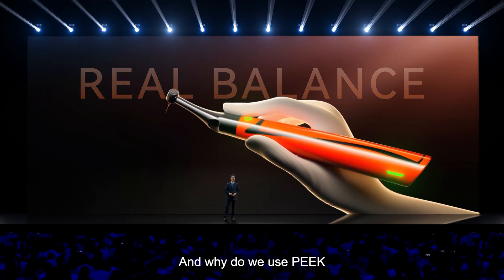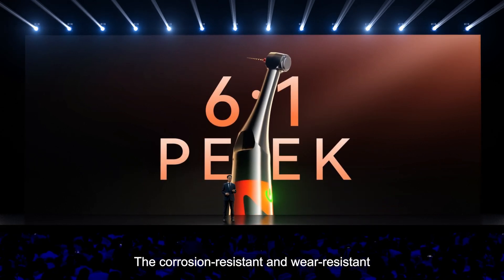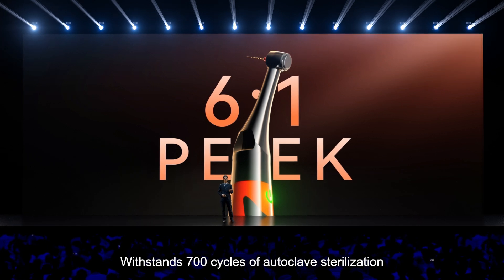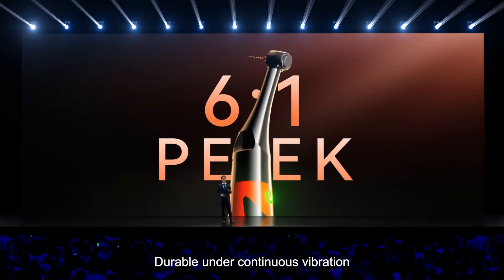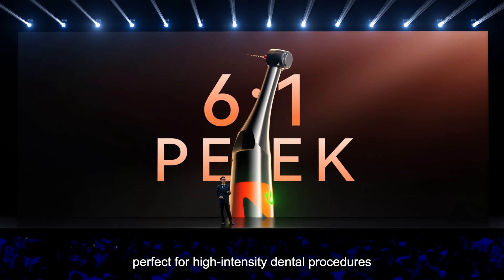And why do we use PEEK? It is corrosion-resistant and wear-resistant, withstanding 700 cycles of autoclave sterilization. It is durable under continuous vibrations, torque, and rotational forces — perfect for high-intensity dental procedures.